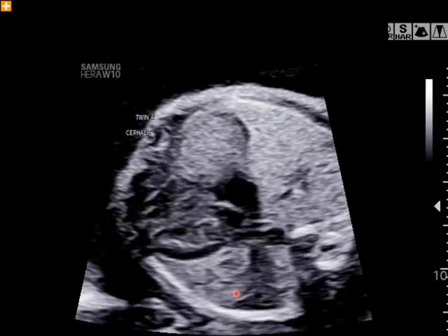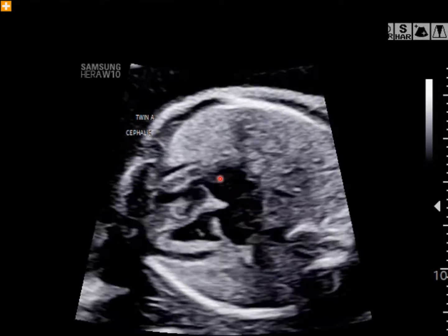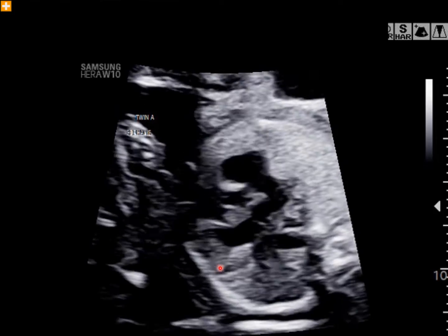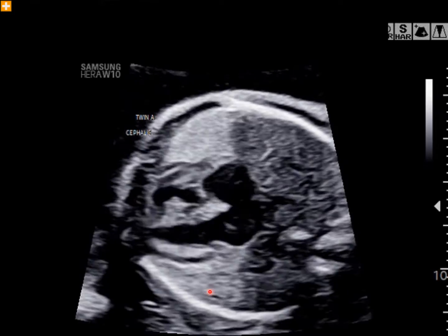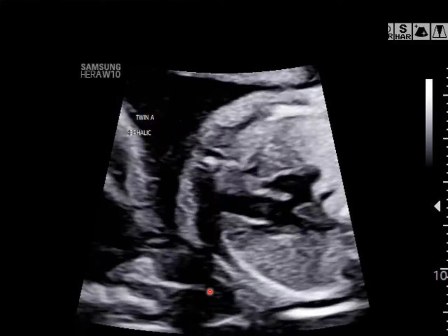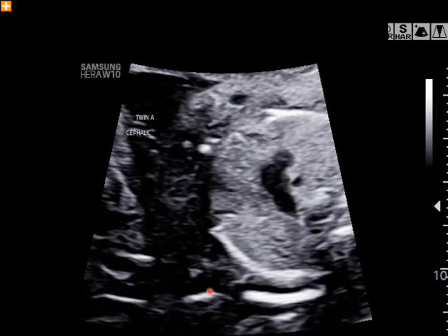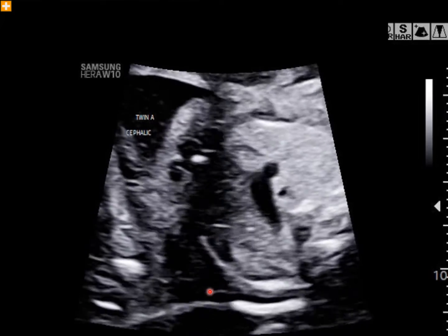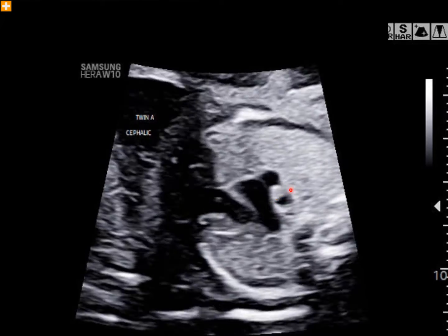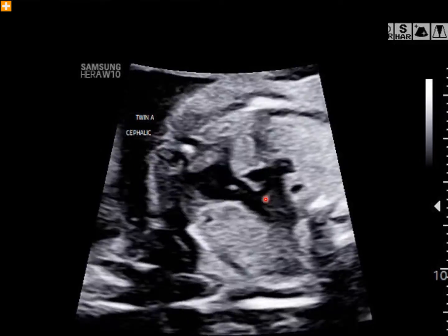And this evaluation through twin A will be complete in terms of all of the views and all of the physiologic assessment throughout twin A, and then we will move to twin B. And so all of these normal sweeps and views through the valves, through the chambers, looking all the way up into the upper chest, showing the 3-vessel tracheal view, nice normal view of that. There, with the trachea here in the center and the left arch, left ductal arch, normal SVC.